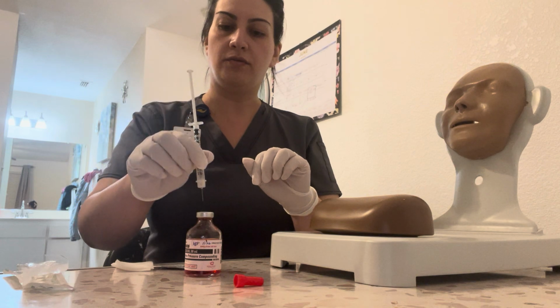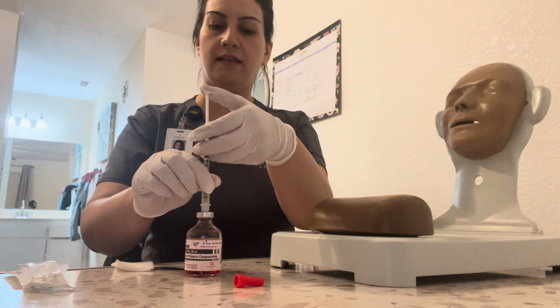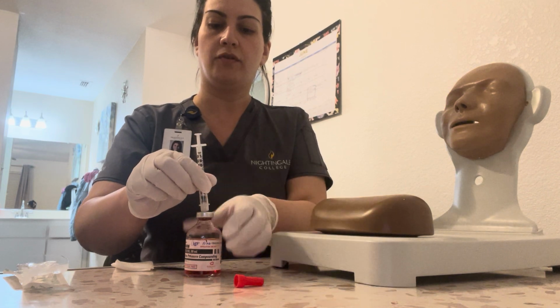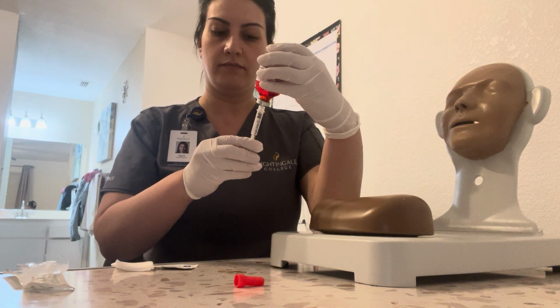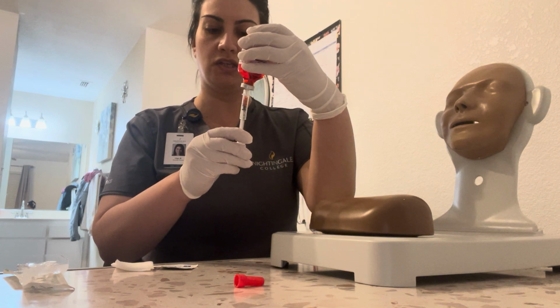We're going to go ahead and push in the air. We're going to invert and draw up the solution to 1.0 milliliters.